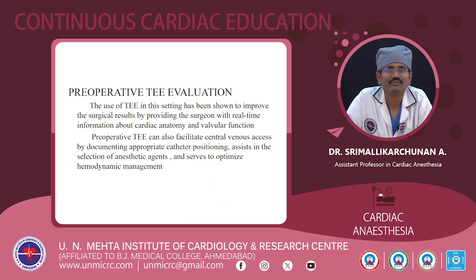Preoperative TE evaluation of the AVCD. The use of TE in this setting has been shown to improve the surgical results by providing the surgeon with real-time information about cardiac anatomy and valvular function. Preoperative TE can also facilitate central venous access by documenting appropriate catheter positioning, assist in the selection of anesthetic agents, and serve to optimize hemodynamic management.